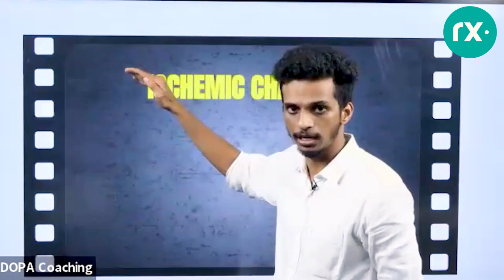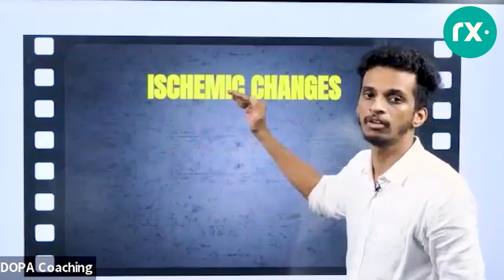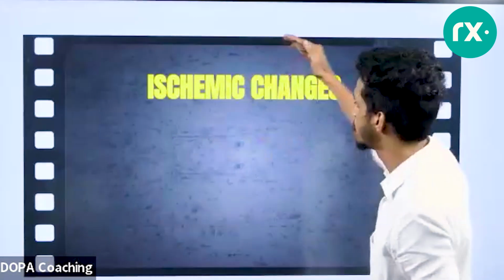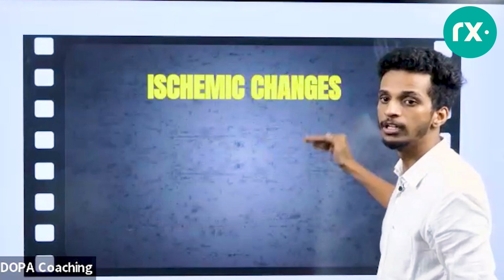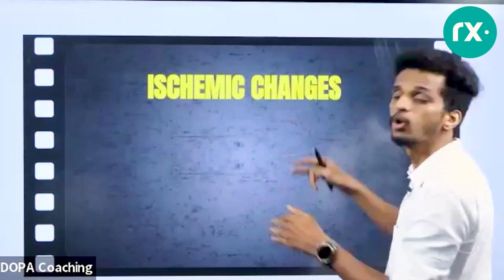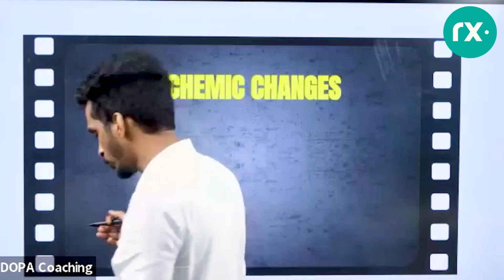And the second one is inferior wall ischemia. How is inferior wall ischemia diagnosed? The changes will be in lead 2, lead 3, and lead AVF. Leads 2, 3, and AVF correspond to the inferior wall. And how will anterior wall ischemia be diagnosed? There will be changes in leads V1, V2, V3, and V4. In the basic session, I discussed that just to go over this topic with you. So we are starting with the ischemic changes. We know which leads correspond to which walls. Well and good. We have two types of ischemic changes.